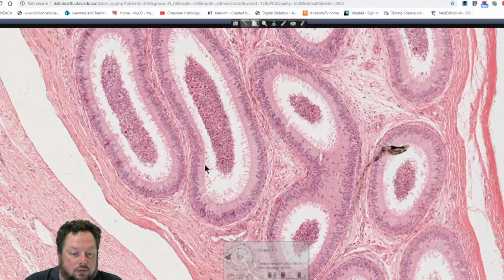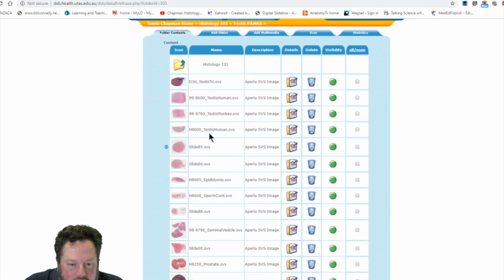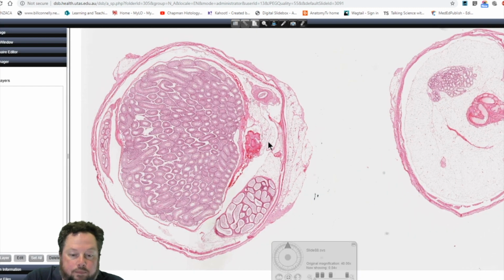All right, so this is the epididymis. We do have a nice section, and I might need to just go back to our slides to work out if I've included that section. It might be in this one. So please bear with me. I think I've got a section where we've actually got, okay.